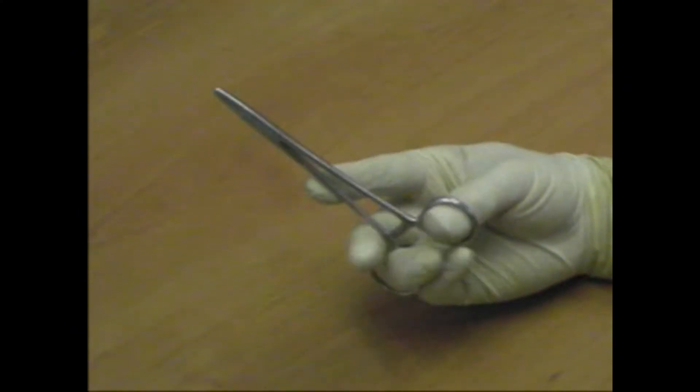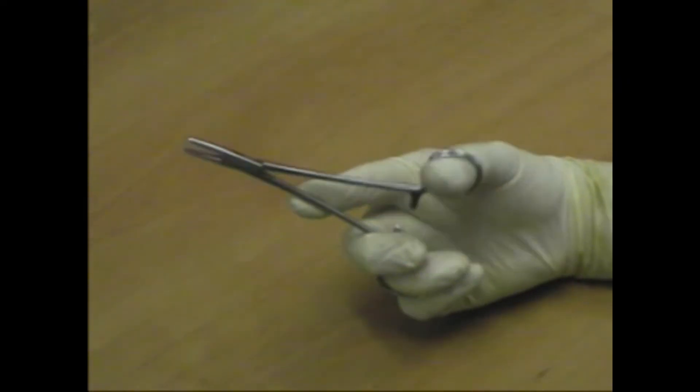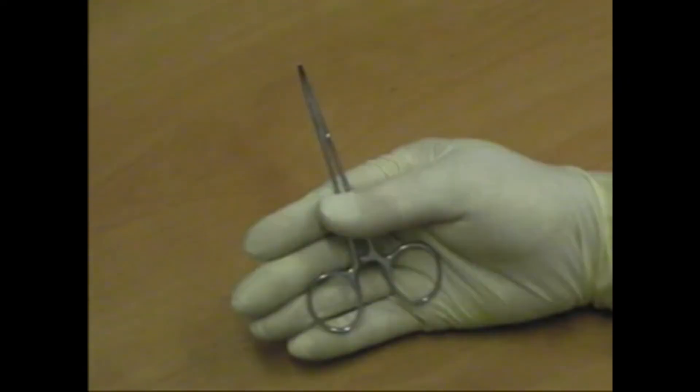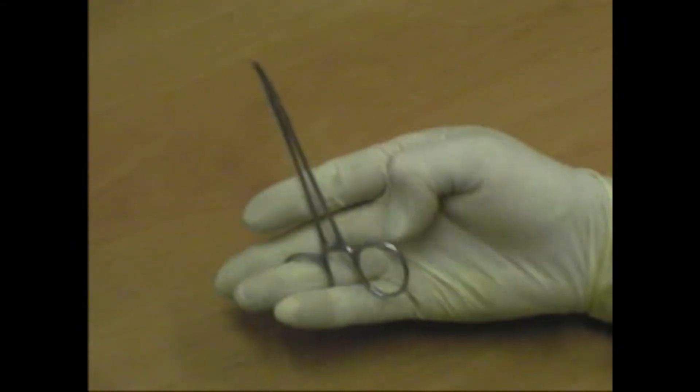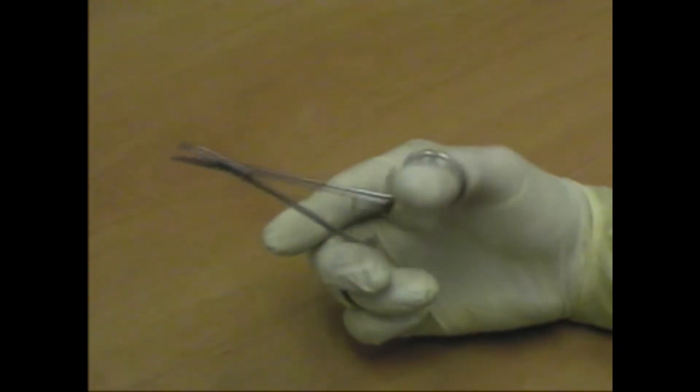Needle holders, artery forceps and scissors are all held in the same way. The ring finger and thumb are placed through the rings of the instrument. The index finger is placed along the shaft and together with the middle finger steadies the instrument.